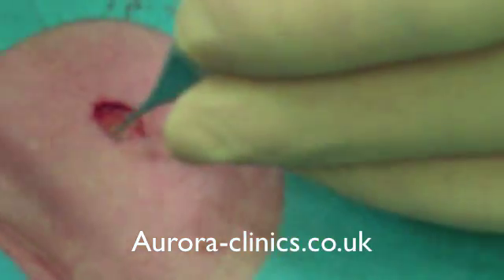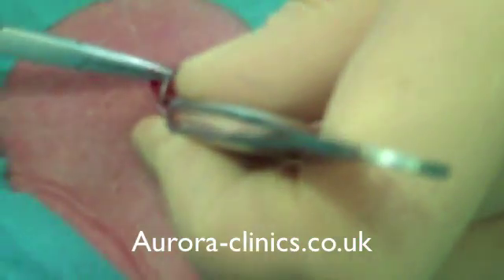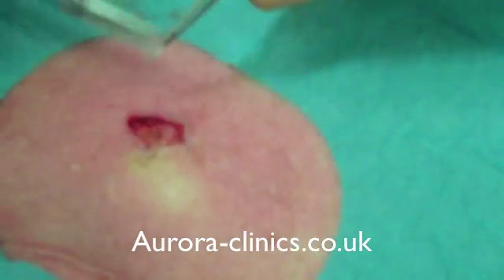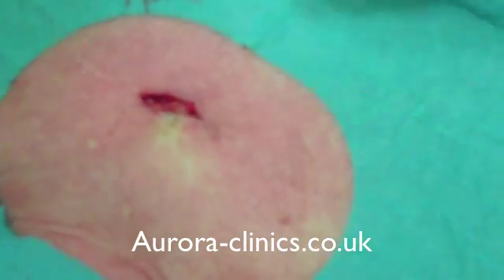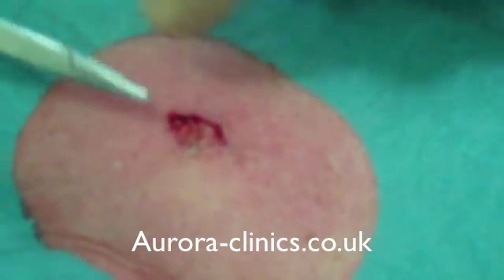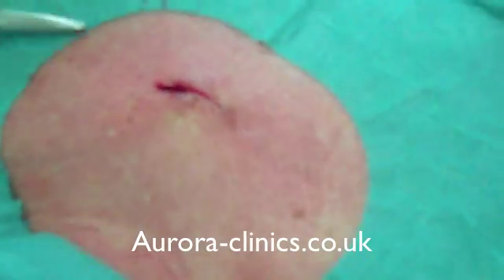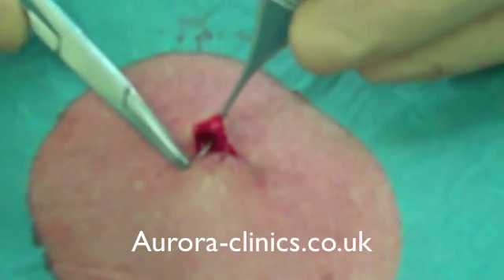For closure, it's just like many other closures we've done, with subcuticular stitches. Often, because it's been inflamed, the area is a bit scarred, so when you take the skin away it does open up significantly. So I use these deep buried stitches of monocryl — 5-0 monocryl in this area.